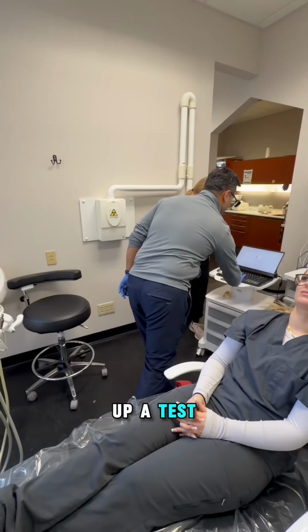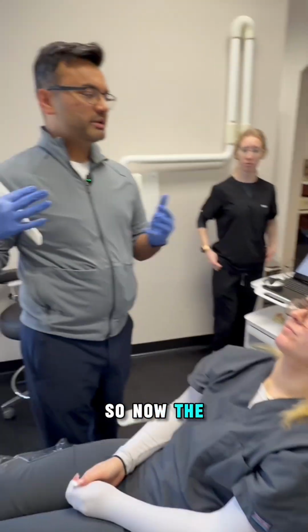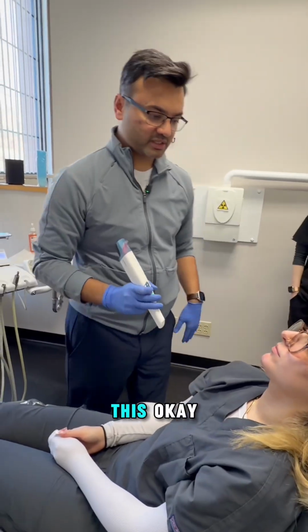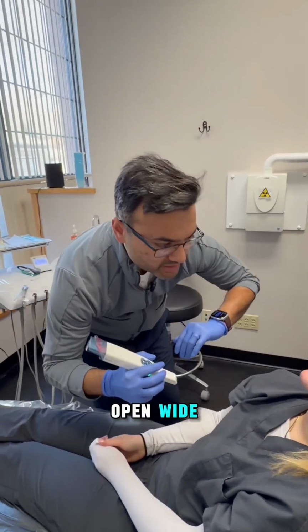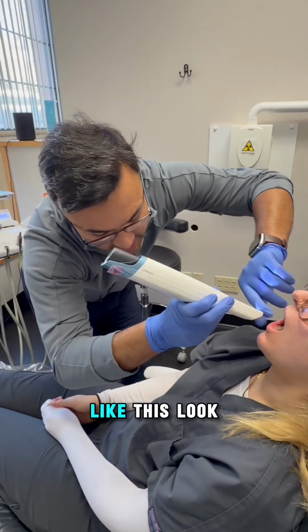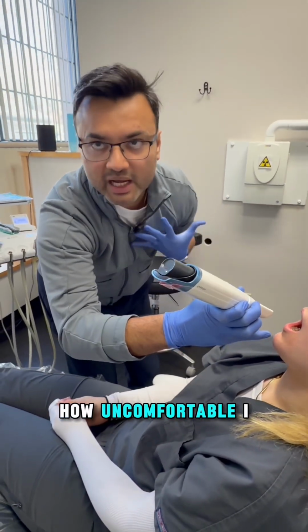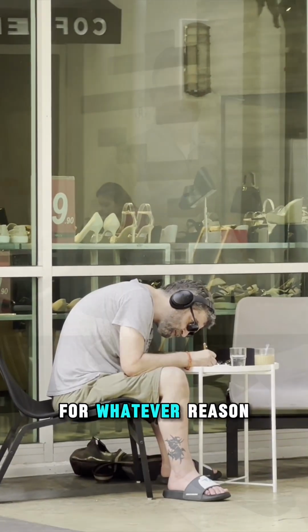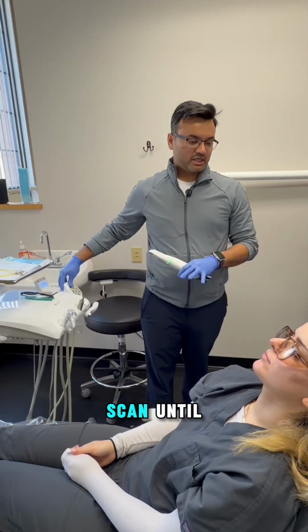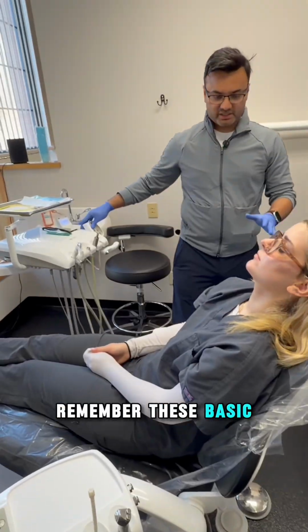Let me pull up a test scan again. Now the biggest problem that I see all the time is the patient in the chair. Okay, we fixed this. Okay, we're going to start scanning with you. Open wide. The assistant is always like this, and we're going to scan like this, like this. Look how uncomfortable I am. For whatever reason, people are not looking at ergonomics. I'm never going to scan until, remember, these basic things.